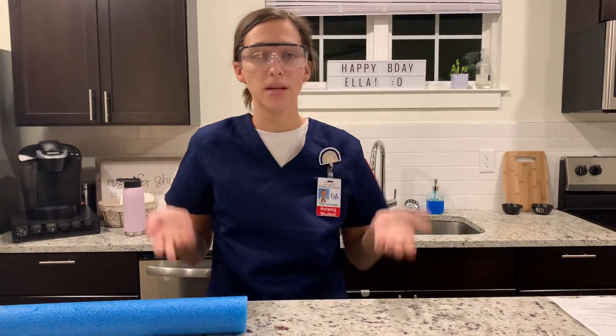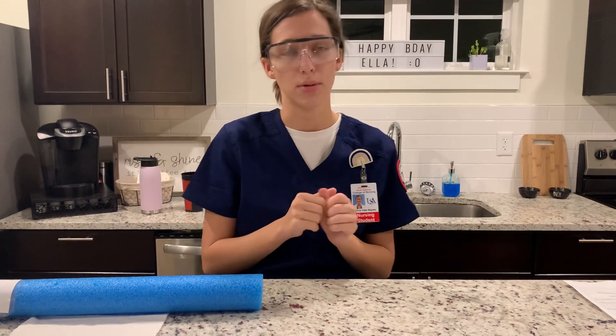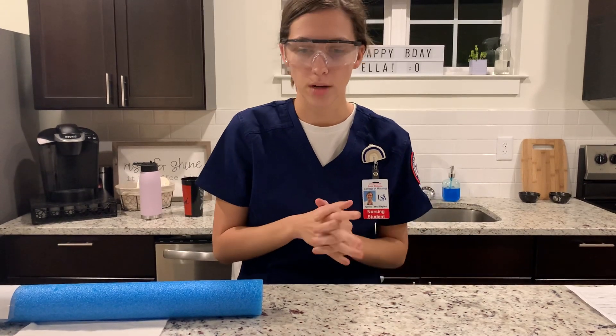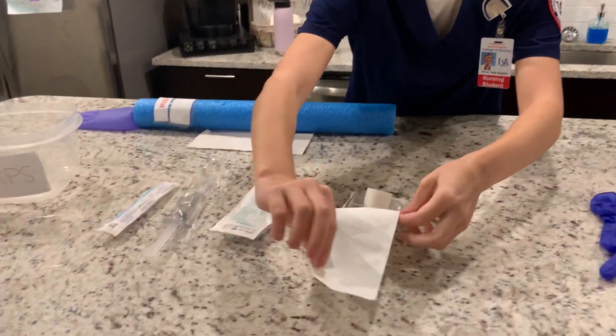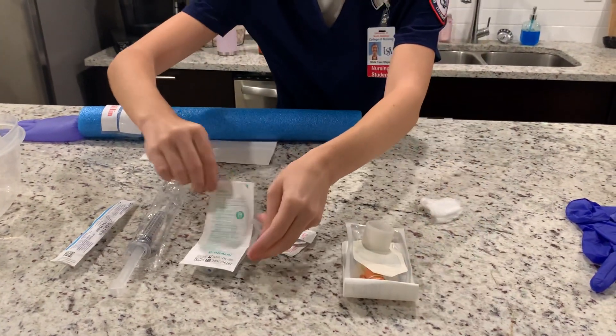Now I'm going to raise the bed to a working height, lower the side rails, and make sure the patient is comfortable and in a supine or sitting position. I'm going to be sure to maintain privacy throughout, and I'm going to open my packages using sterile technique.